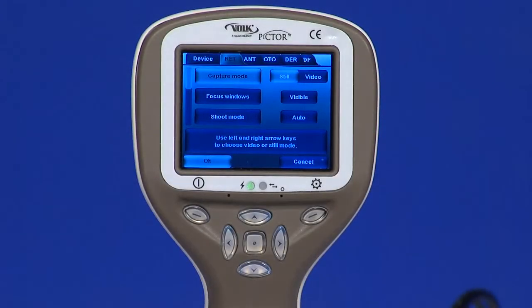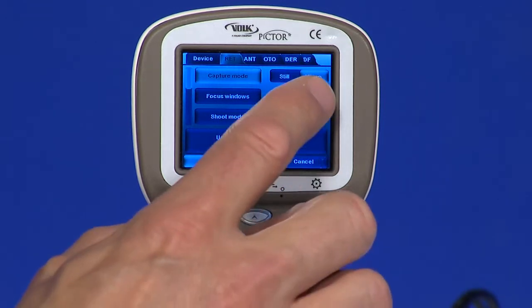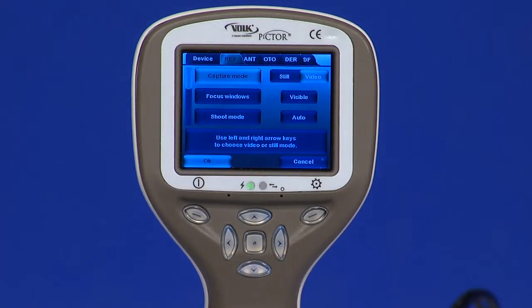Let's take a look at the menu options associated with the retinal module. Capture mode: both still images and video can be taken with the Pictor camera. When taking video, the shutter button must be held down. The video recording will stop once the shutter button is released.